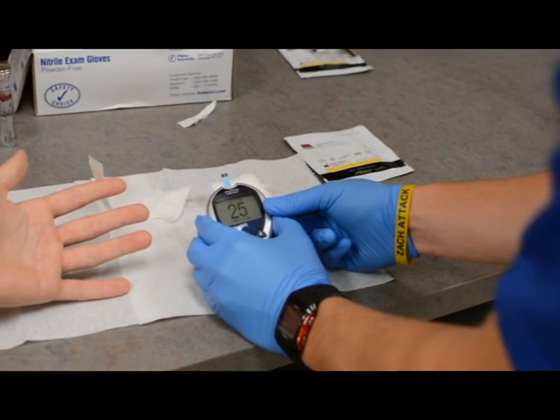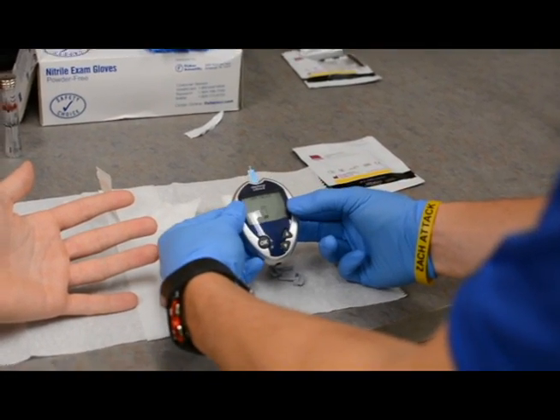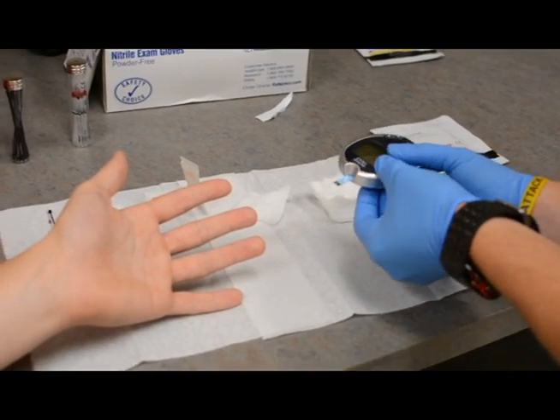You're going to need to wait a few seconds to make sure that the glucometer is ready to accept the sample. What you're going to look for is a little test strip on the screen with a droplet of blood — that means it's ready to take your sample.